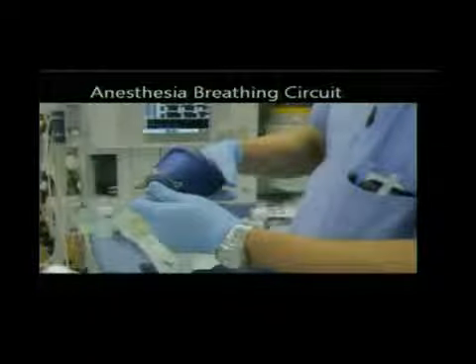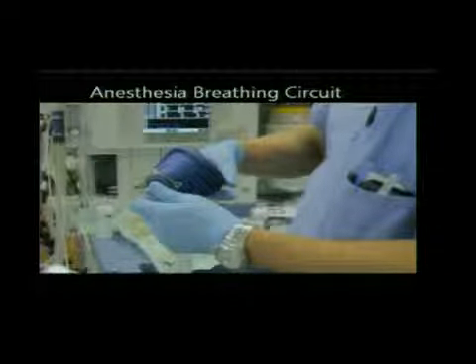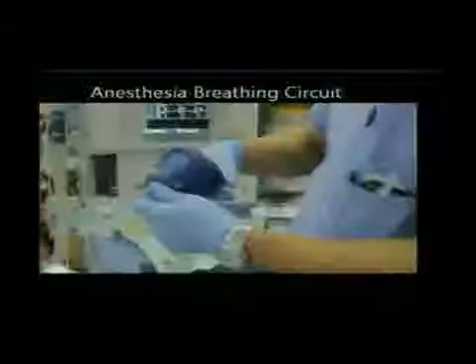Please pause. This is the anesthesia breathing circuit. We've talked about ways of opening the trachea and the lungs to air, but something's got to move the air. If the patient is being sedated, hopefully the patient's own diaphragm and chest will expand and contract and move air in and out of the lungs. But if the patient won't move air, we have to do it. We have to have a way of forcing air into the lungs if the patient isn't breathing. And that is the anesthesia breathing circuit.